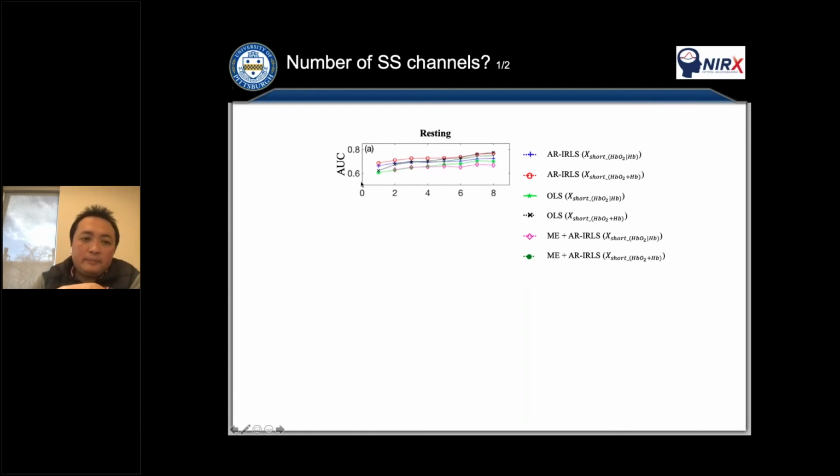You can see for resting state data, when you add more short separation channels, from the nearest short separation channel 1 to 8, the performance, or the AUC, also increases. Again, the autoregressive is the best one compared with the OLS, for the AUC and, of course, for the type 1 error too.